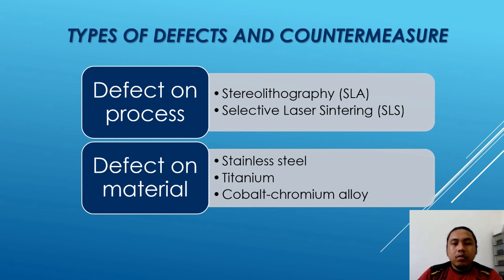The countermeasure to this defect is to clean and wash the parts with solvent to remove wet resin, and further cure the parts to make sure they are safe for human use, and dry them before using the parts in a medical implant.